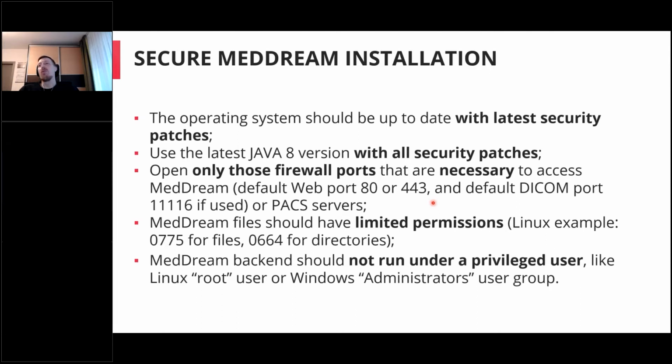And also, when you run the MedDream service, for example on Linux, it is really not recommended to run the service as root, or as administrator on the Windows side. It's better to have a separate user for this.